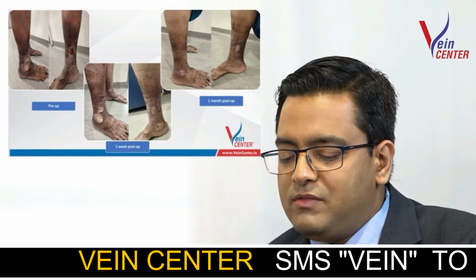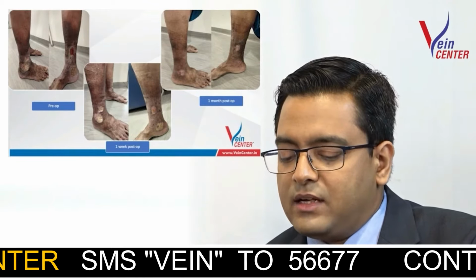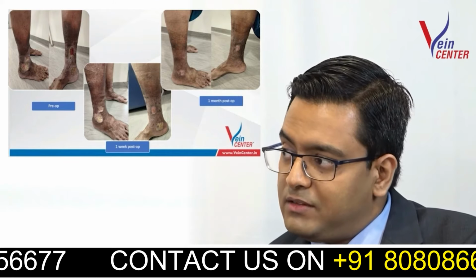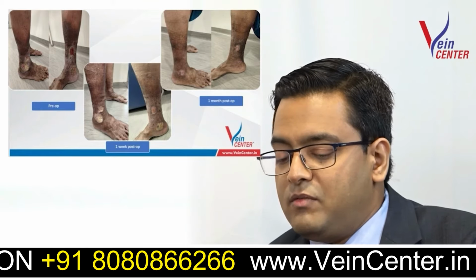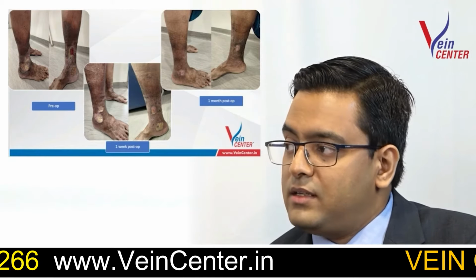Over here we see this lady with large wounds on the legs, varicose ulcers at the calves, outside of the ankle and on the calf, and skin darkening. Here we have modified the VenaSeal procedure, where we call it flipping the device. Instead of treating from the ankle up, we treat it from the calf down, so that more of the vein is treated under the ulcer.